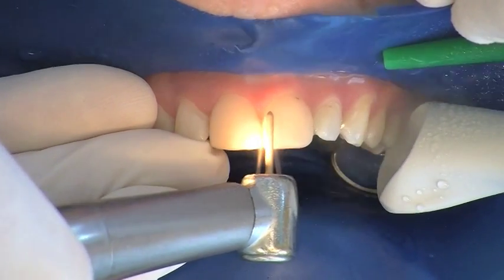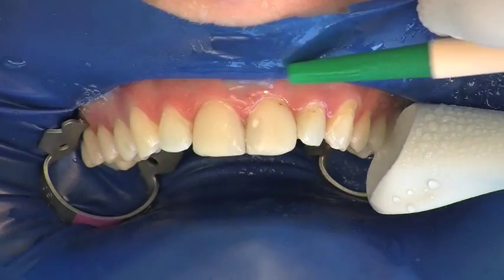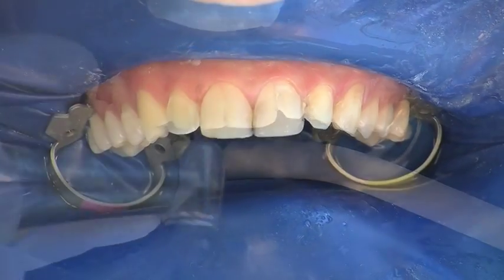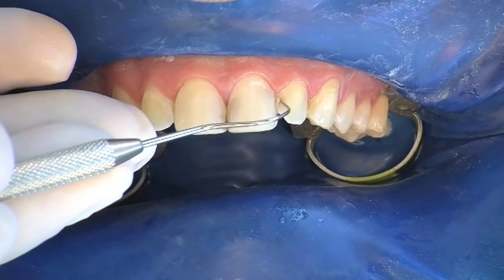A defined preparation margin, as well as shortening of the incisal edges, is not necessary. The teeth are checked for caries and old fillings.